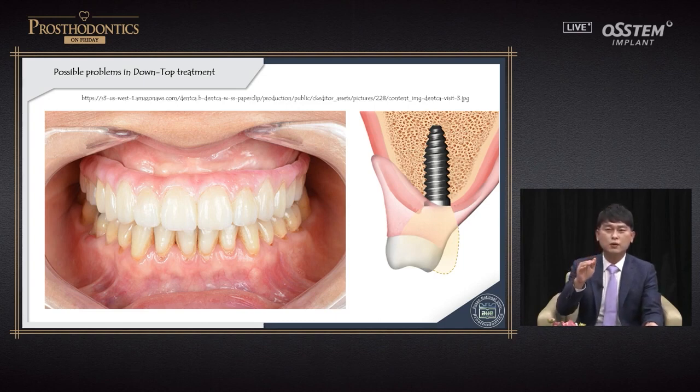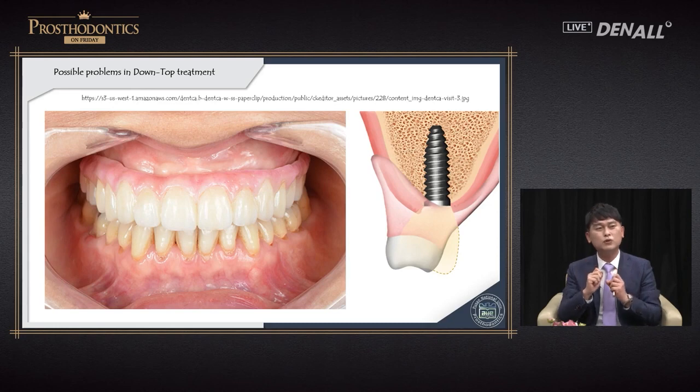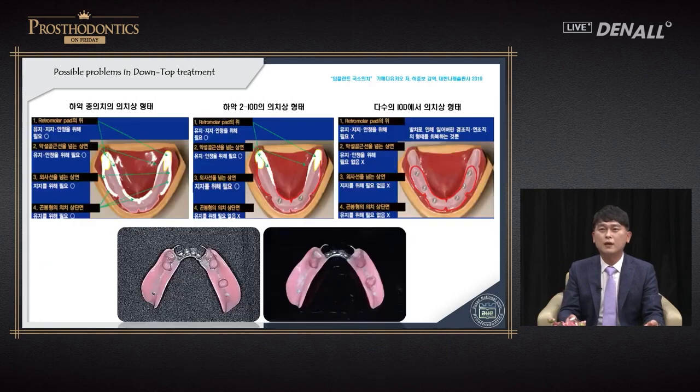So this is a precision design not covering the denture base completely. Not every day, but every week or every 2 to 3 days, the patient can retrieve it to clean it. With this backdrop, I chose the topic of today's lecture.